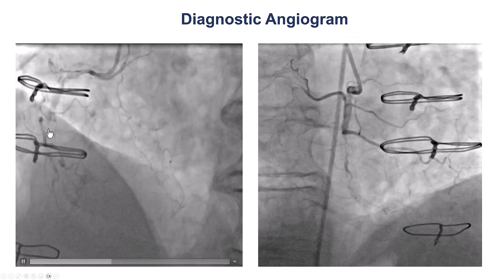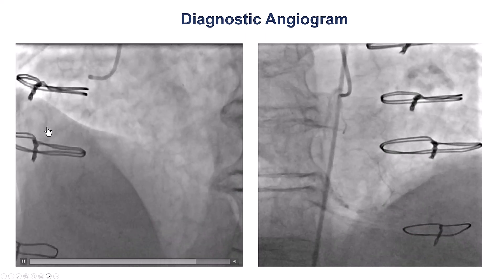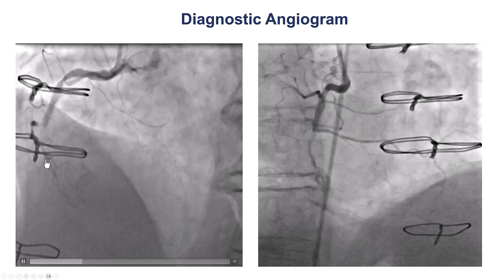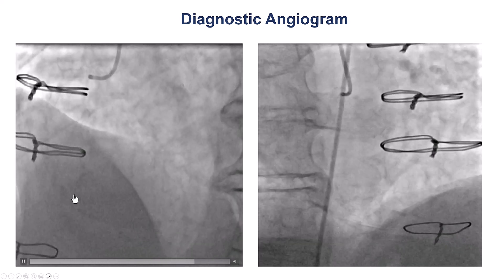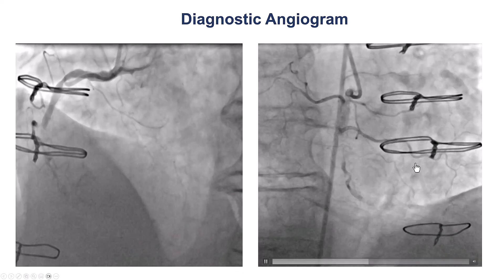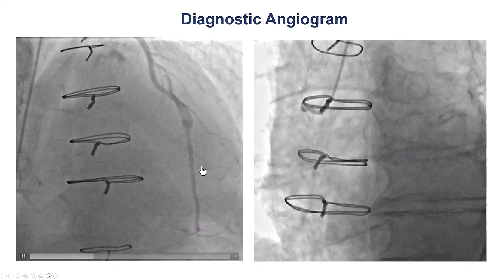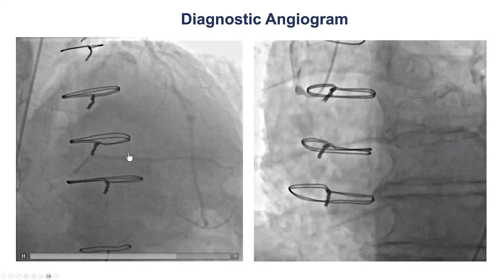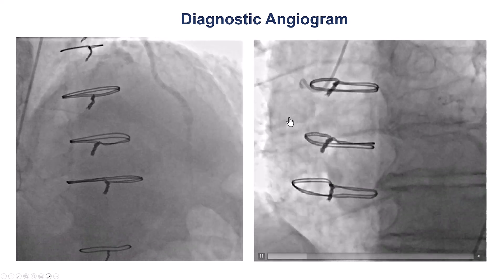The diagnostic angiogram shows a clear proximal cap, but there is an acute marginal arising close to the proximal cap. There is significant calcification through the occlusion, and the distal vessel is filling via both ipsilateral and contralateral collaterals. There were some epicardials filling the right posterolateral. The saphenous vein graft to the RCA was occluded.